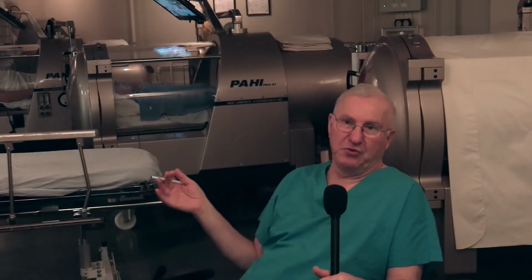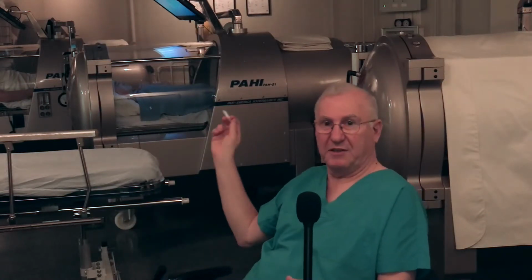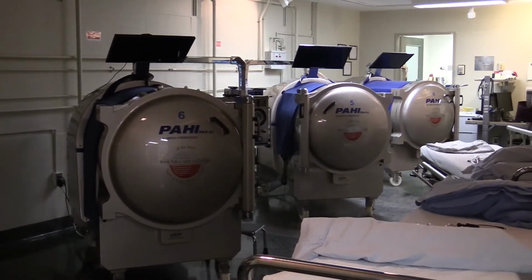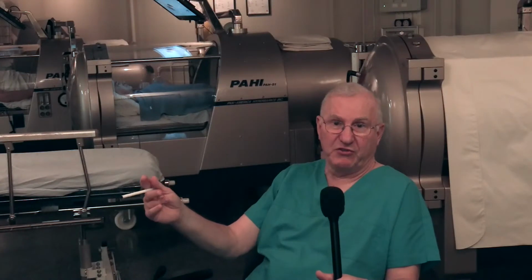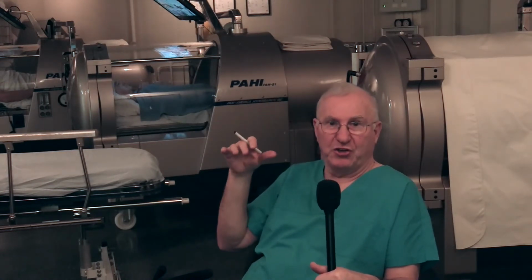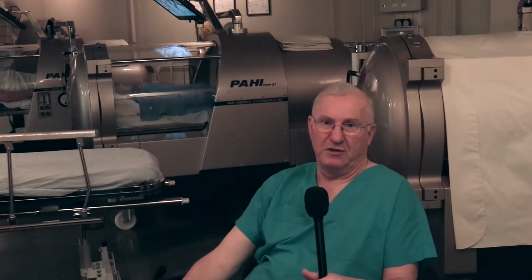The pressure that the patients are exposed to is equivalent to a scuba diver, let's say, or snorkeler going to 33 feet of water. So imagine yourself at sea surface and going down 33 feet. So the pressure at 33 feet is the same as what the patients are exposed to. If you breathe oxygen normally, that oxygen gets only to part of your body, if you are in a compromised situation, like most of our patients are. However, if you are exposed to pressure, the pressure of the chamber, pressure of the gas, forces oxygen to go all the way to the extremities.